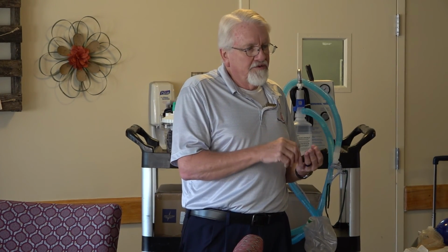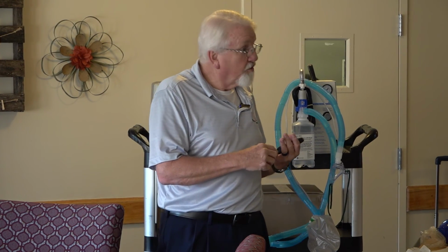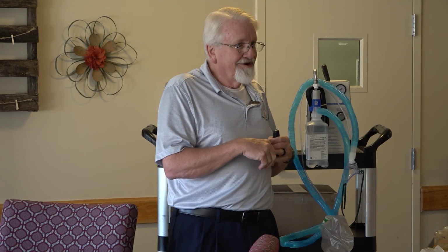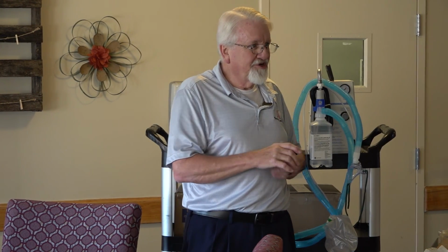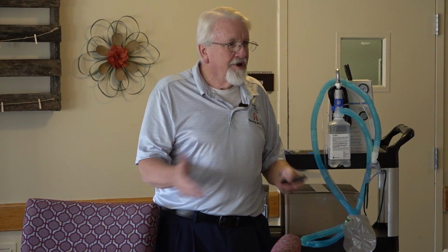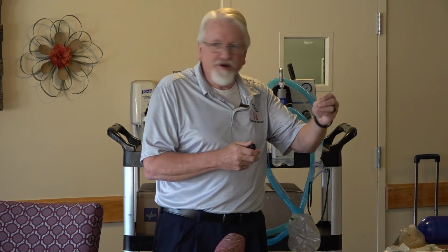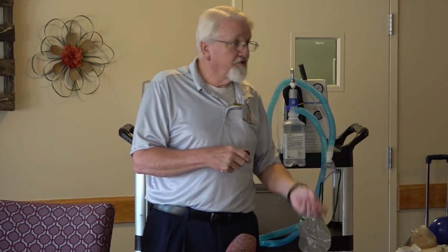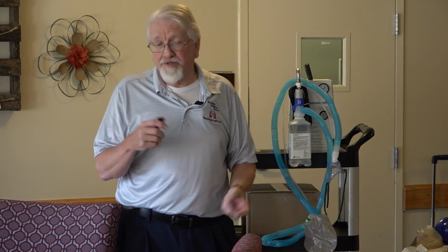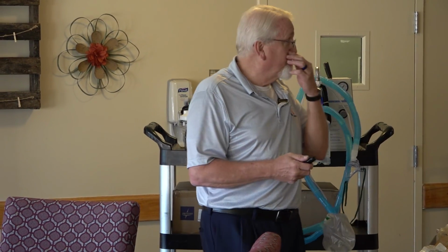So we will usually try to request a SAT order that's a range, not be restricted to 2 liters, where you have to turn them up to 4 and then you're not following the order. We would rather have an order that says maintain SAT greater than 95%. That way if I need 2 liters, I can do 2. If I need 4, I can do 4. So if you can get the doctor to go that way for you, that's what you would prefer to have.